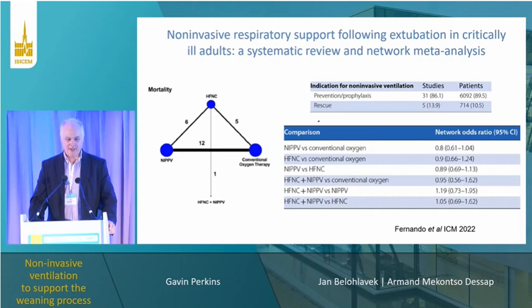I'm now going to focus on the previous Cochrane review, which looked at non-invasive technology as a whole. This network meta-analysis and systematic review, published recently in Intensive Care Medicine by Shannon Fernando and colleagues, looks at the effect of the different modalities. Again, this is a pooled population of studies. It included studies with both preventative and rescue therapy. One can see in the bottom side of the chart that compared to conventional oxygen therapy, either non-invasive ventilation or high-flow nasal cannulas were superior to conventional oxygenation, with no effect for mortality across the group of outcomes there.